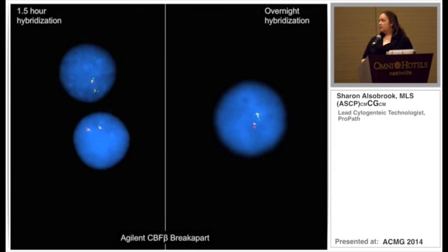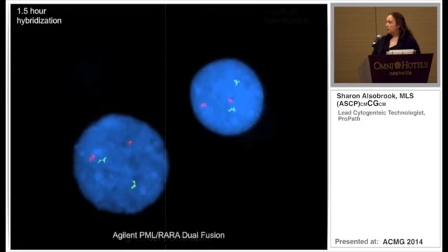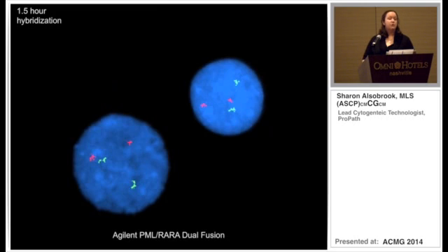This is a comparison of the hour-and-a-half hybridization to overnight hybridization. This is using the same probe, so just comparing, shortening the hybridization did not decrease the quality of what we were looking at. It stayed the same or got better. And a very important one would be PML RARA, which is useful for getting a 3-hour total turnaround time.